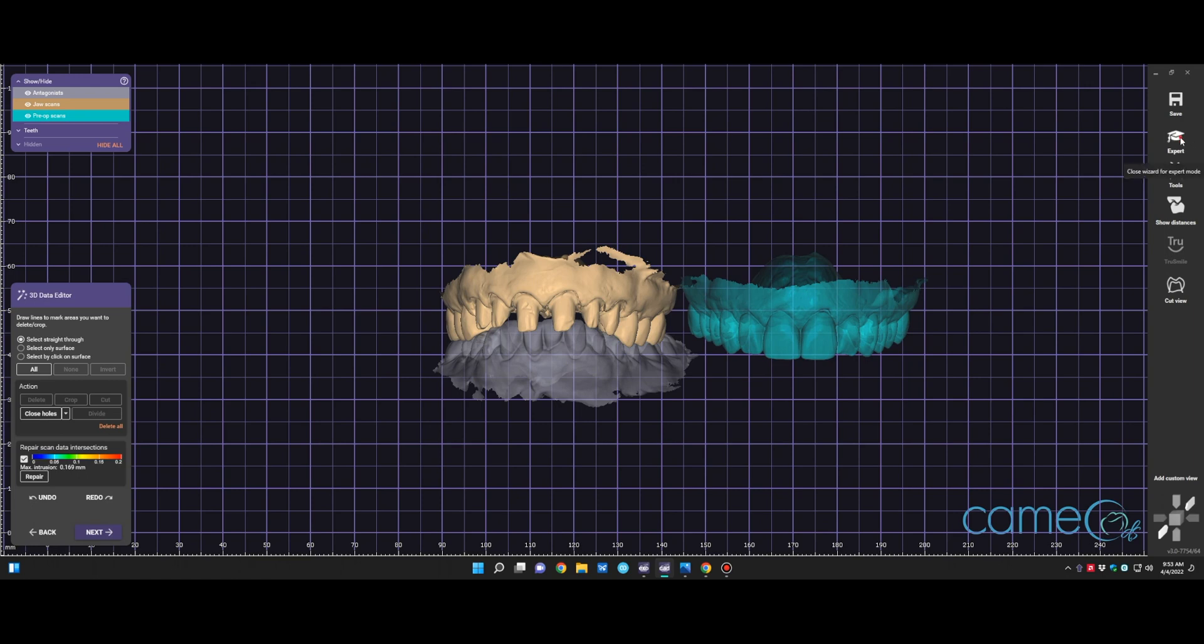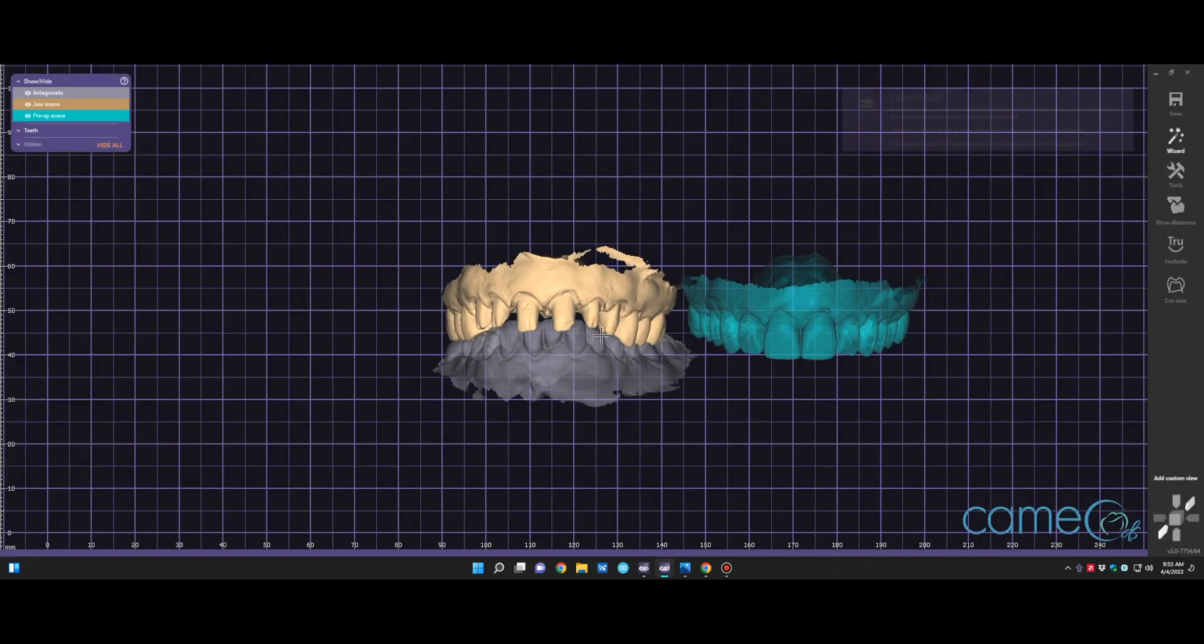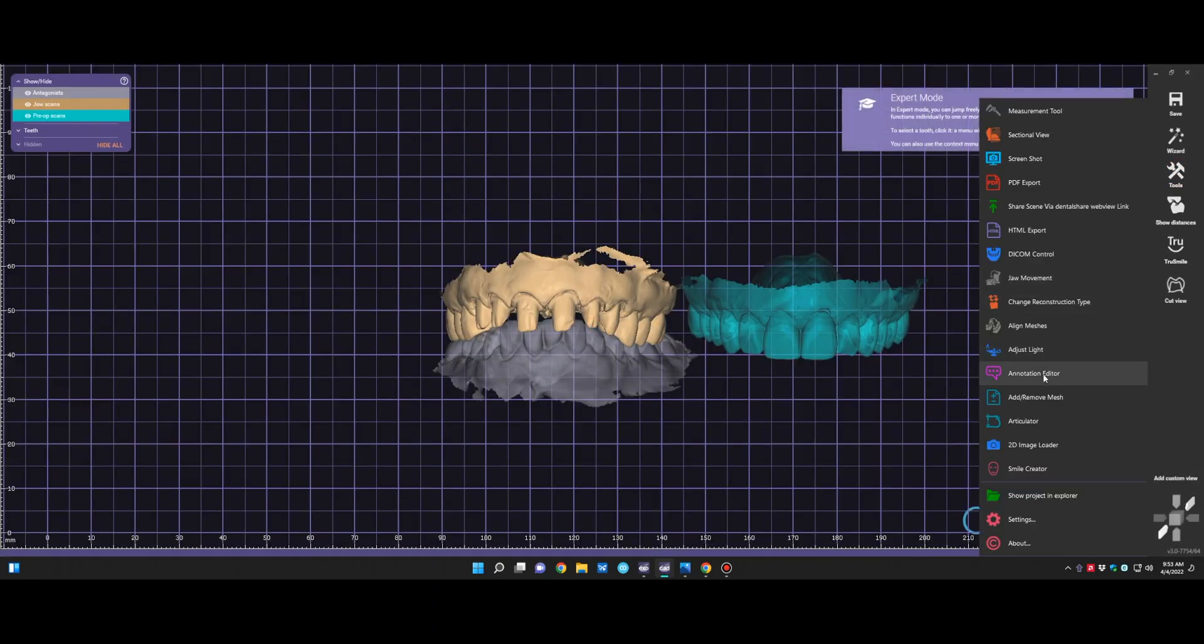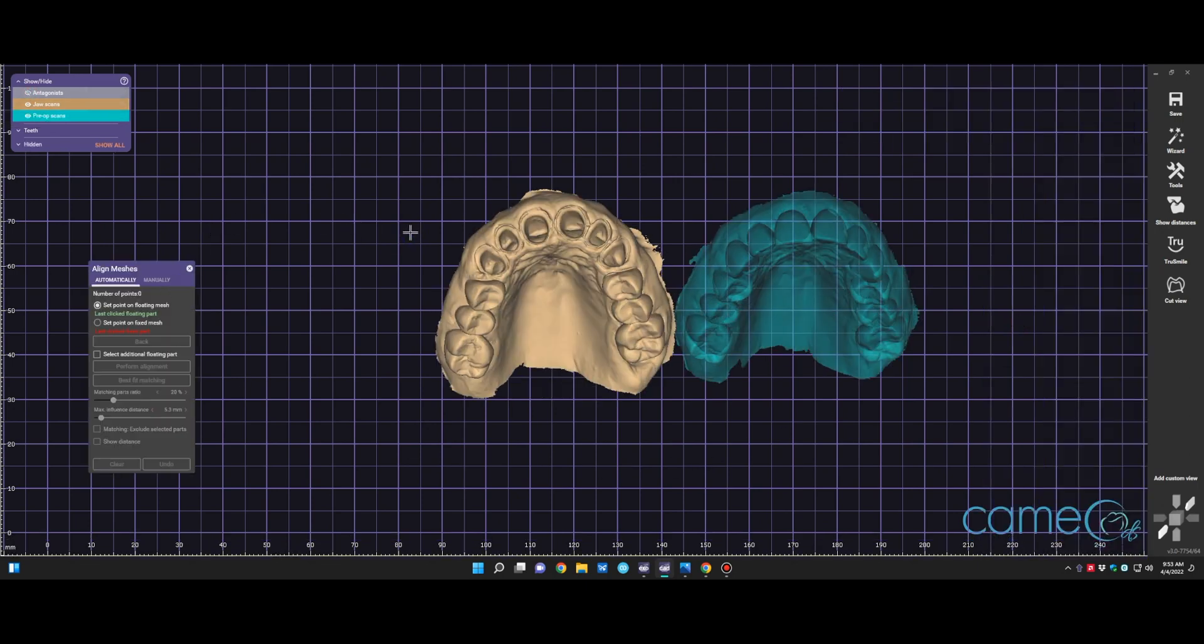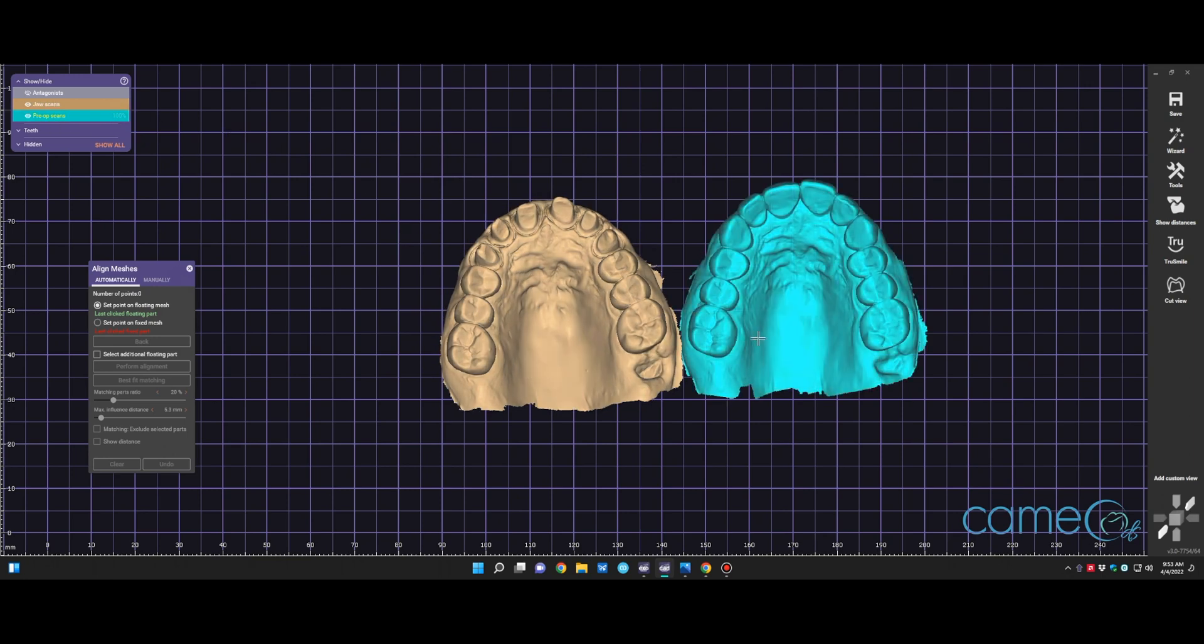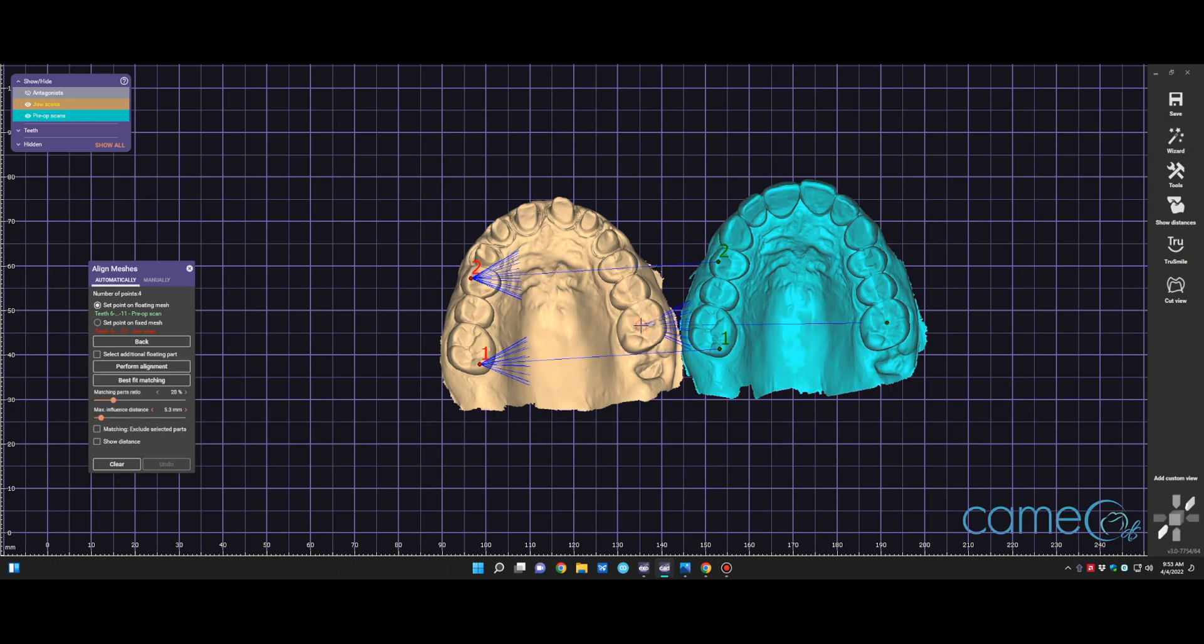So you saw that we aligned the meshes there, or moved it, and we're going to go into expert mode, go into tools, and align the meshes. At this point, we'll turn off any scan that we don't like, so the antagonist there. And we will click on points of reference first on the floating scan, and where we think it is on the jaw scan. You can do as many as you'd like. Sometimes we'll do three, sometimes we'll do more. In this case, we did three, or actually, we're going to do four.